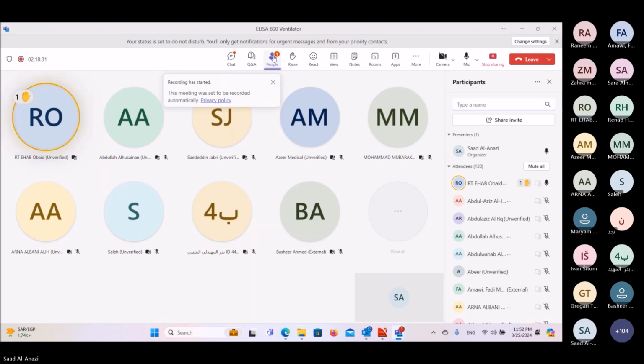Yes, the CPR mode is really a great option to have. The CPR mode has two levels of pressure. You can select the two pressure levels and increase the FiO2.